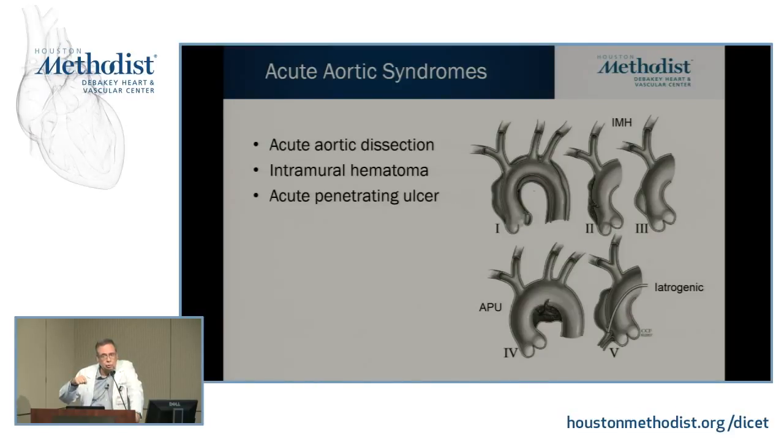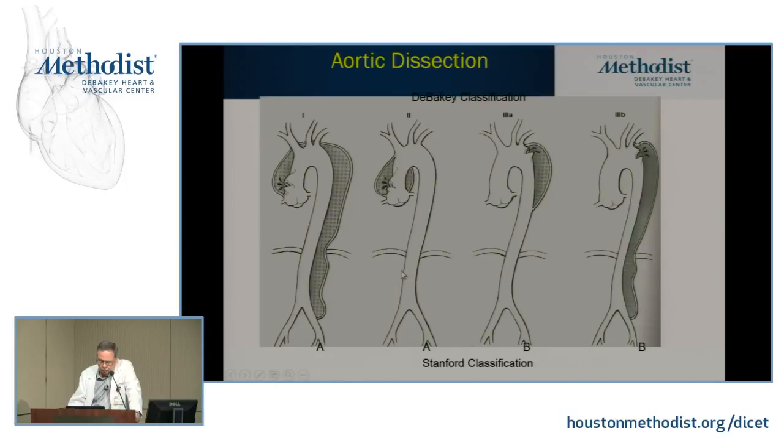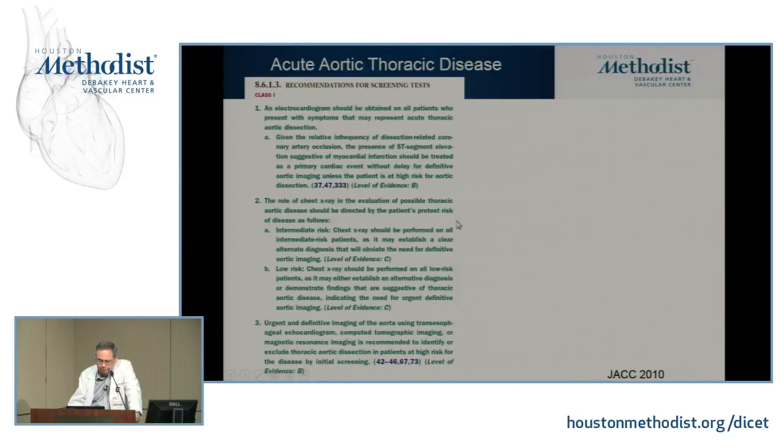Now, more and more institutions are beginning to use gated CT, but still many places out there, they have the good old radiology sitting in the box doing a regular CT. And there are big differences between what you get in quality, resolution, between that type of CT and the gated CT, and forget about CMR. Many places still don't have the quality that we have here. So you may have to pick up your probe and use it in these entities. I'm not going to talk much about this since we don't use them too much. And you know this already. And you know all of this already.